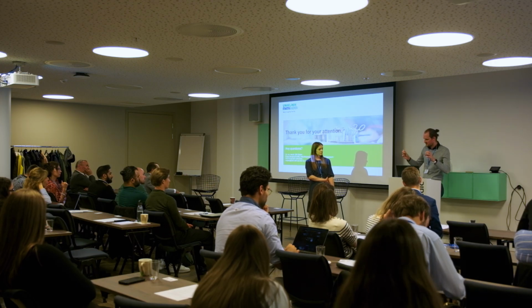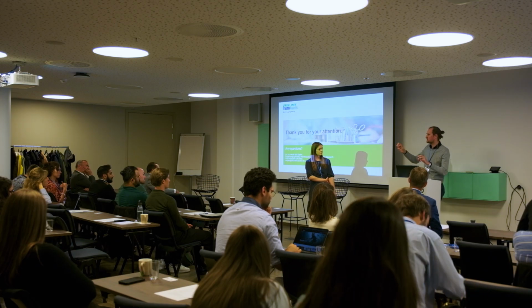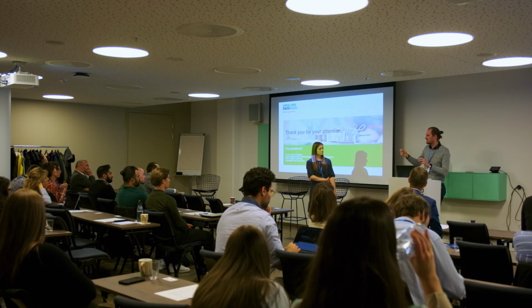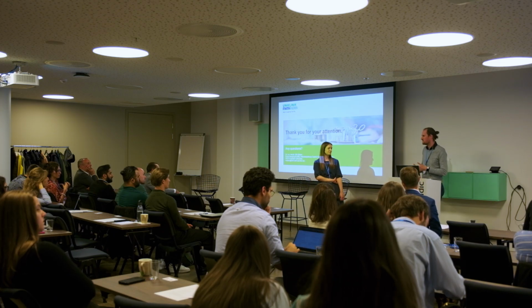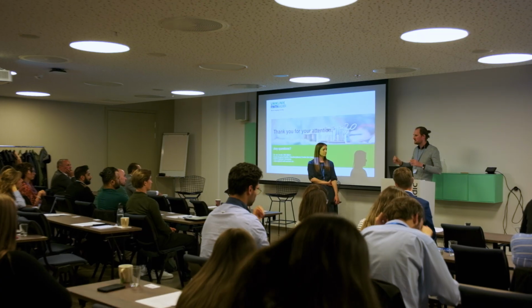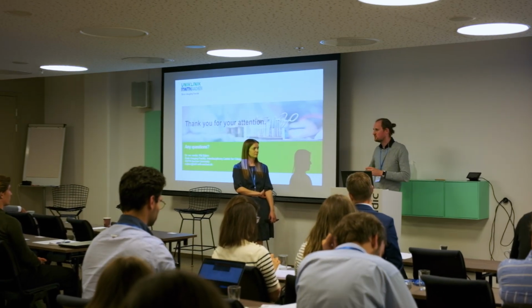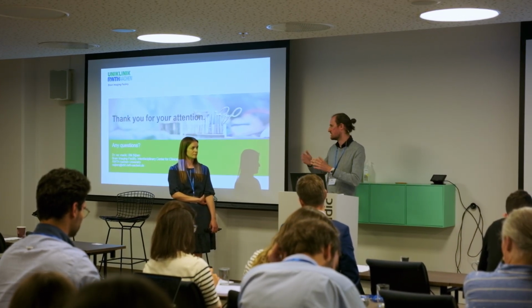But I was worried that this would make an imbalance, because then the server would kind of be faster. Turns out it really didn't matter, but we figured we have a PC which we can use as a server, so we just locally host this, and then we can run them independently. And this also allows us to do quick pilots behaviorally, because we can connect to the same server using any other PCs.